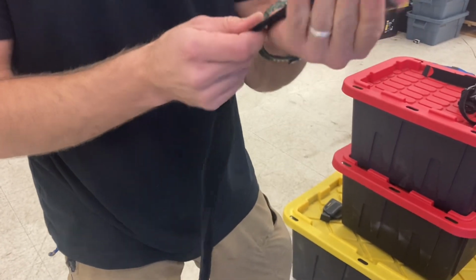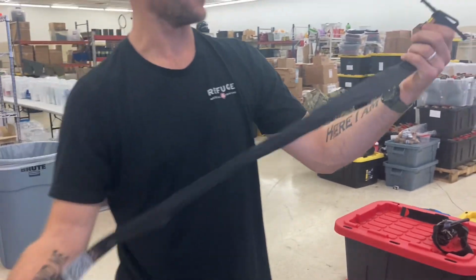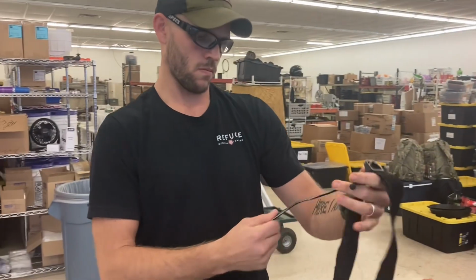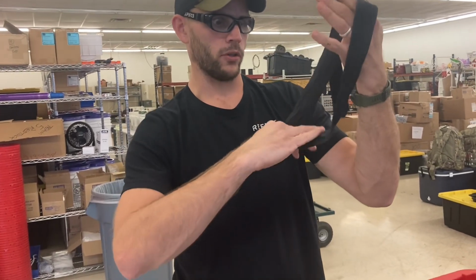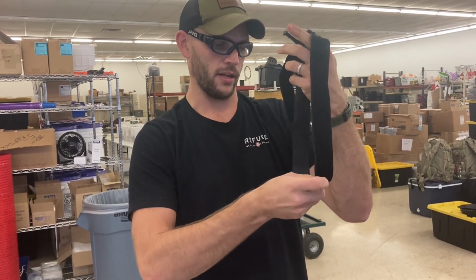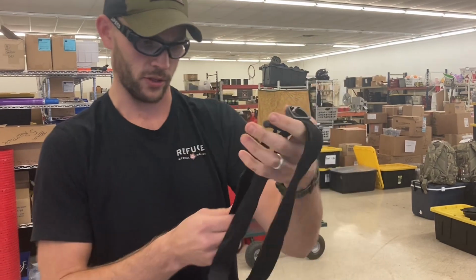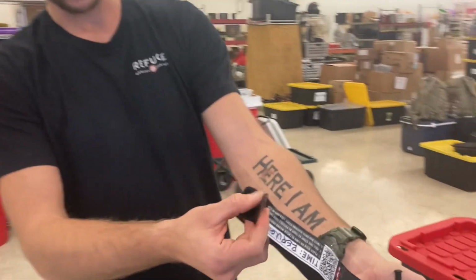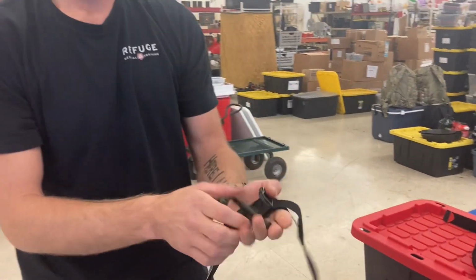Okay, let's see if I can get ready. Try to twist the other way. I know we did torque on the windlass pretty good originally. I got to give that credit. I don't think I'm going to be able to break it. That windlass is solid. Yeah, absolutely. That's a good feature. And this tab is good. I don't have to fold it over like I do that one to get the handle.